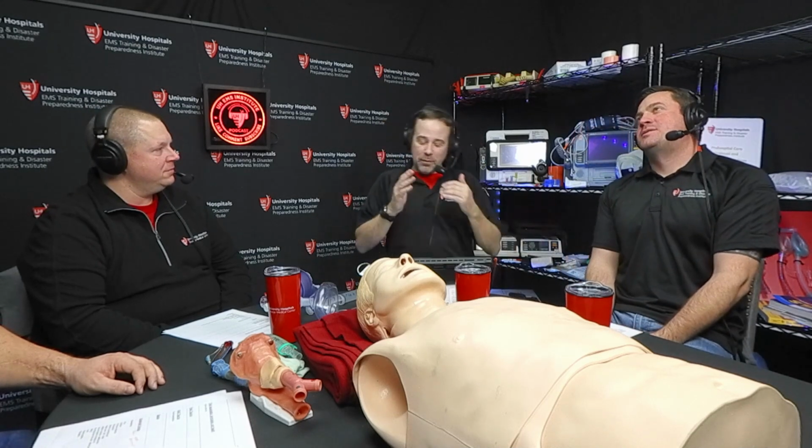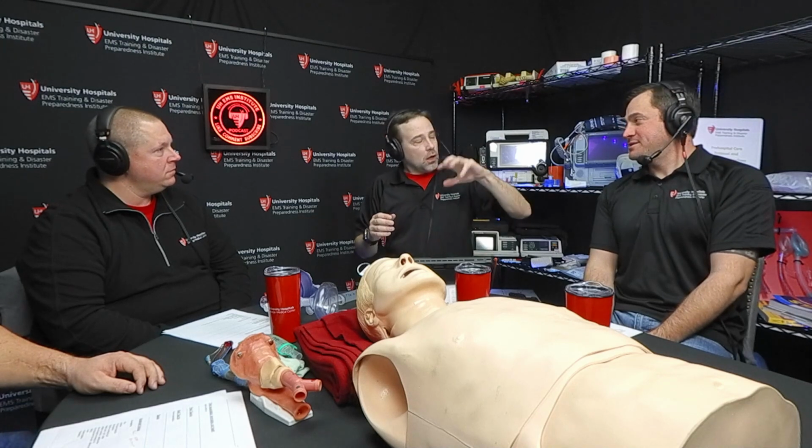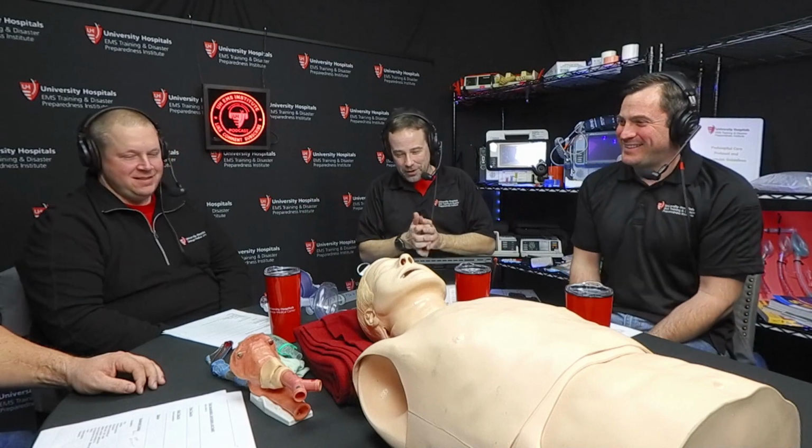You're talking about, but anyway, you've got somebody that's on CPAP and they were oxygenating well but getting tired, and you're like, okay, I need to begin ventilating, or watching that CO2 rise, we've got to ventilate this guy, right? Well, you already have a mask in place, and it's hands-free. I'll let you get there, and Ray can grab it off the shelf for you over his shoulder.